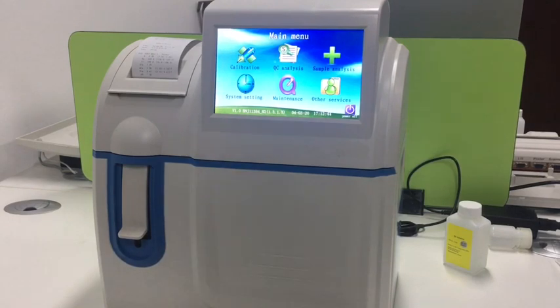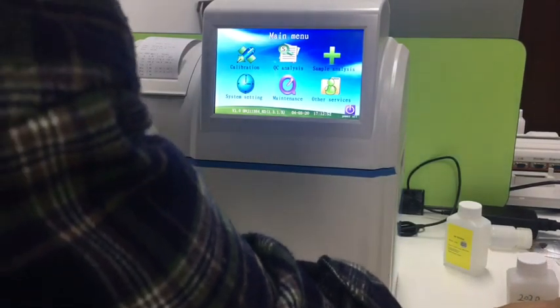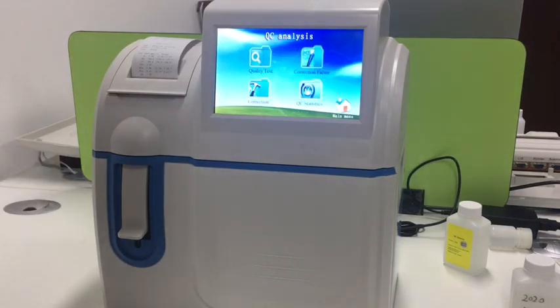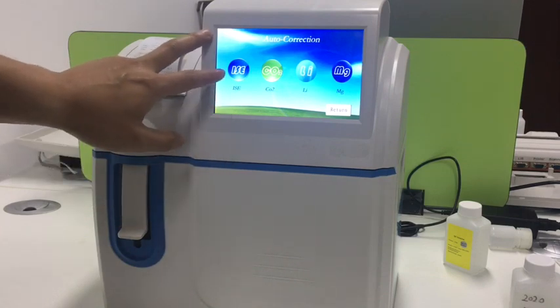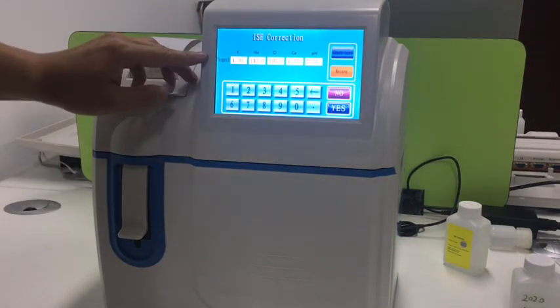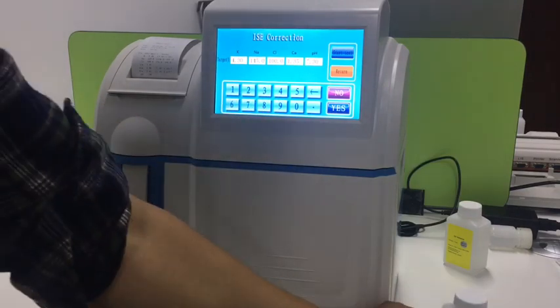Now let's show you the one-point correction. Here we still use the QC solution. Press QC analysis and go into correction. This is for electrodes, so we select ISE for one-point correction. Here are the target values of the QC solution.